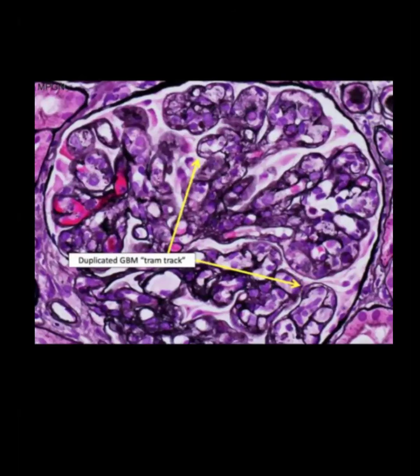Again, you can see here the glomerular basement membrane is looking very beautiful. Either it will be membranous or it will be MPGN. Here it is a clear-cut double tram track appearance. What are the differential diagnoses of double tram track? Yes, Dr. Sarah. Sir, it's MPGN, transplant glomerulopathy, and chronic antibody-mediated rejection.